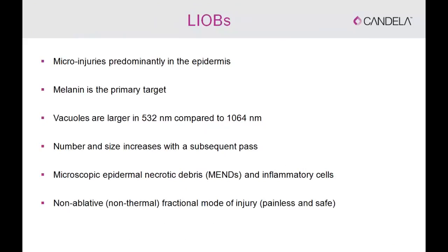And then that LIOB, the light-induced optical breakdown vacuole, generates a cascade of wound healing process and an inflammatory response that leads to tissue remodeling, but also, interestingly, to microscopic epidermal necrotic debris, and that also helps with clearance of pigmentation. So one could view the Resolve handpiece as a fractional, non-ablative, but non-thermal handpiece, and that's why it's painless and safe in darker skin types and does not require anesthesia.